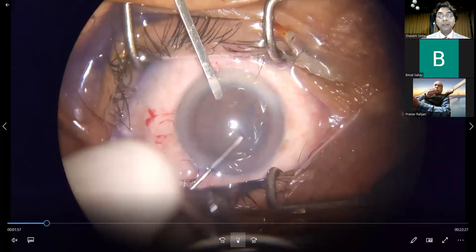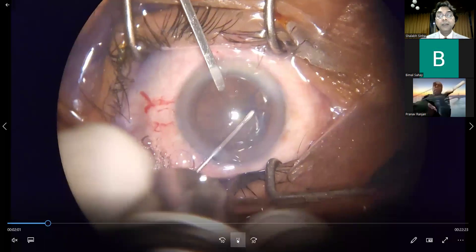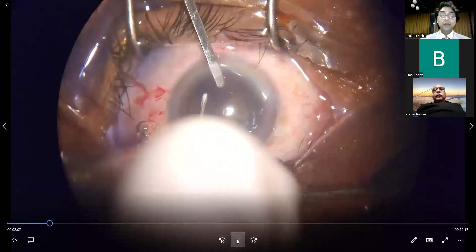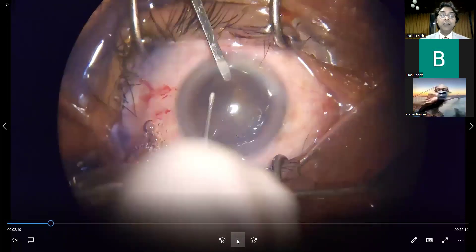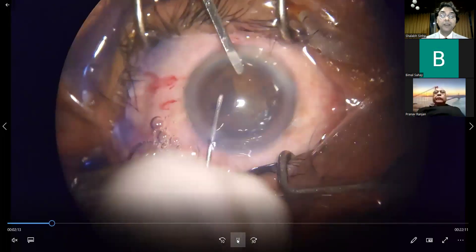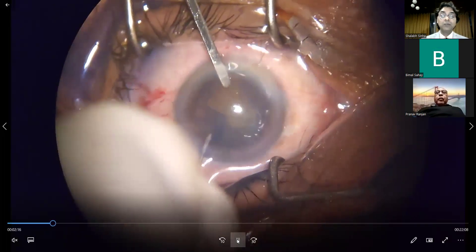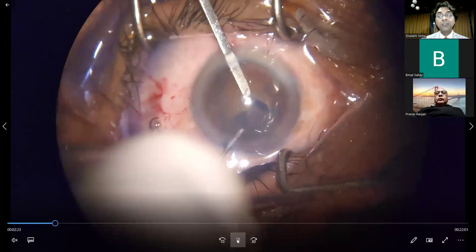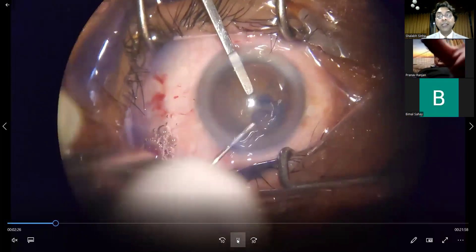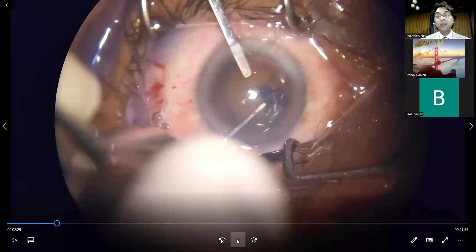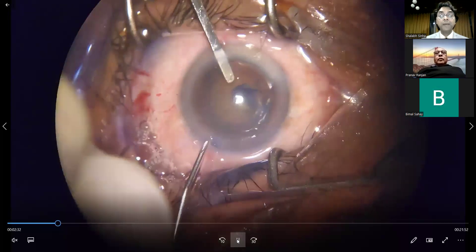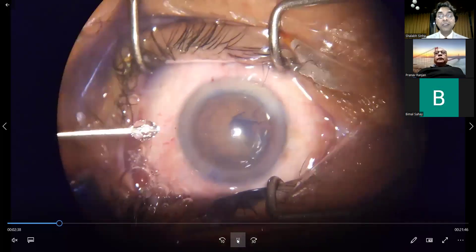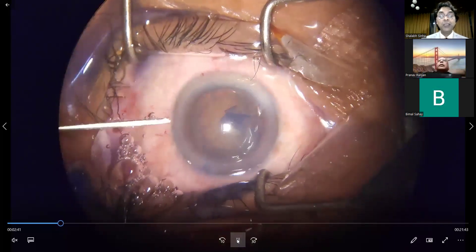Using a bent 26-gauge needle fashioned as a cystitome, the anterior capsular flap is raised and placed over the anterior capsule. This flap is rotated all around to give a circular anterior capsular opening. The spatula not only stabilizes the globe but can also be used to flatten the flap. We have accomplished a central capsulorhexis, followed by the hydro procedure.